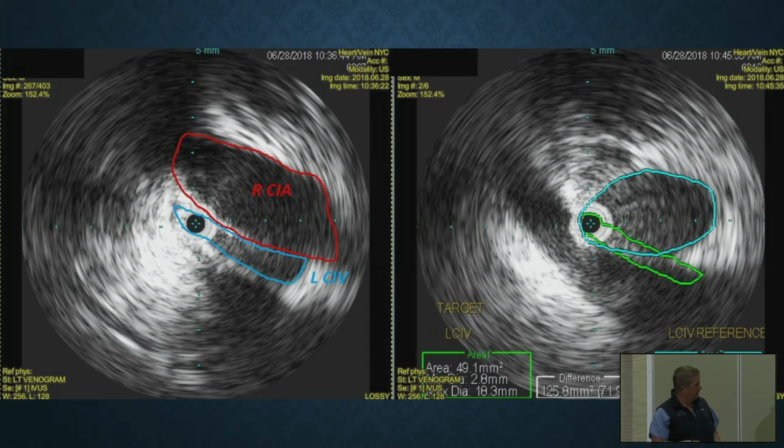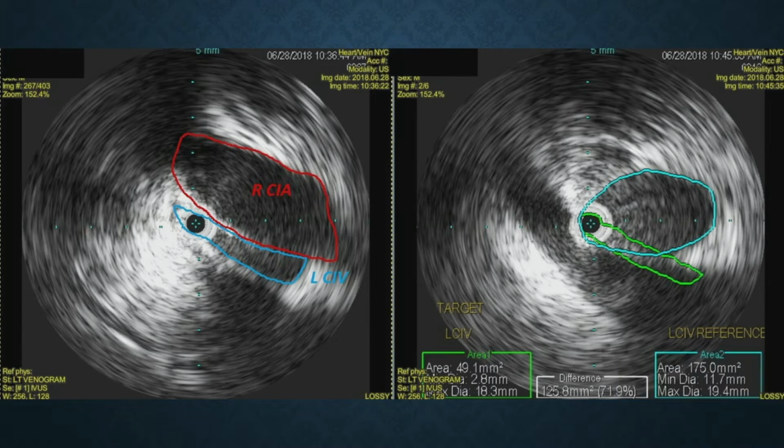And so not only can it give us an accurate measurement of the amount of stenosis, but it can also give us diameter measurements, which allow for more accurate sizing of stents. Because the last thing we want are stents to go floating up into the pulmonary system. You lose points for that. Also, intravascular ultrasound can tell you where normal vessel diameter starts and ends, because you always want to treat from normal to normal with the pathology in between. Does that make sense?